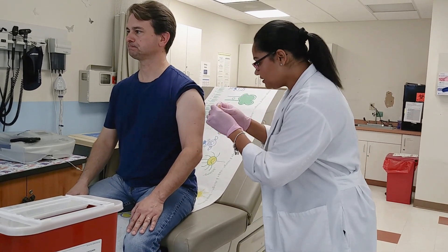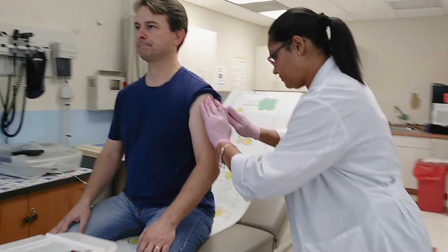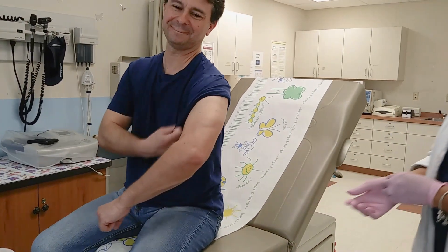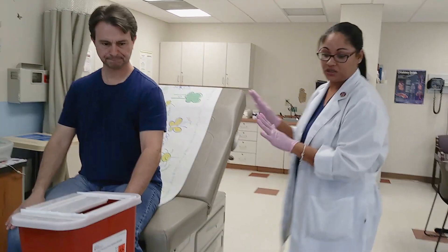We'll go ahead and put a Band-Aid on right there to keep blood off his shirt — just a little drop. Since it's still the same patient, I'm not going to have to re-wash to change gloves. It's up to you if you want to change gloves — you could do a hand sanitizer in between — but it's the same patient.